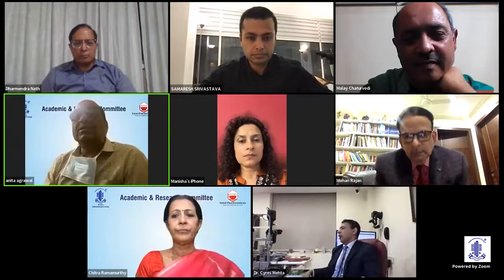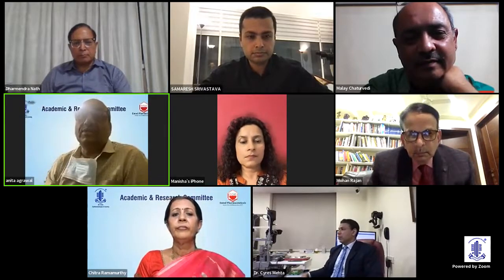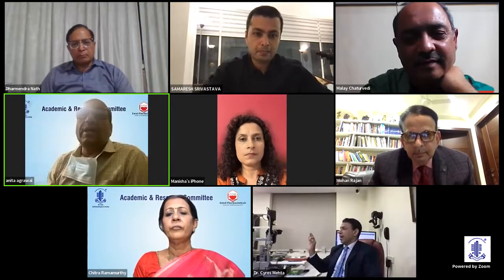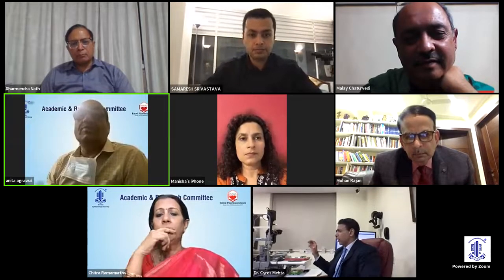And the good message is that the vitreous needs to be respected. Vitreous needs to be managed before doing further maneuvers. Because if you maneuver with the vitreous in the AC, then you will enlarge the tear. You will have more of the products of the vitreous. So vitreous needs to be addressed first. That is very, very important.